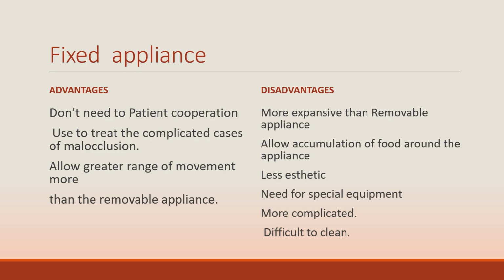They allow accumulation of food around the appliances, which worsens the brushing of the teeth. They are less aesthetic, need special equipment, are more complicated for doctors, and are difficult to clean.